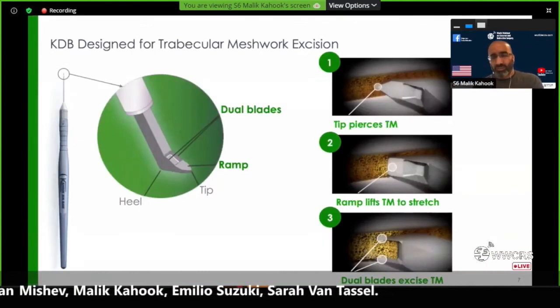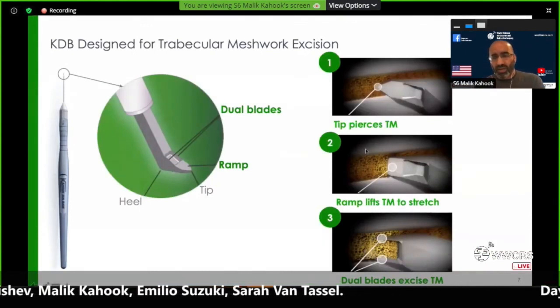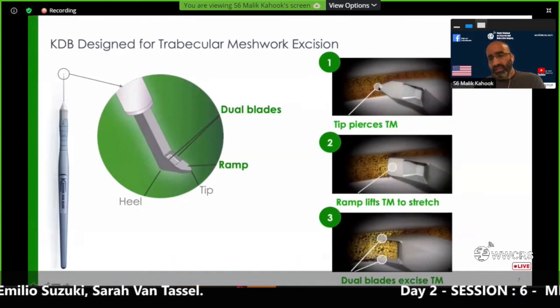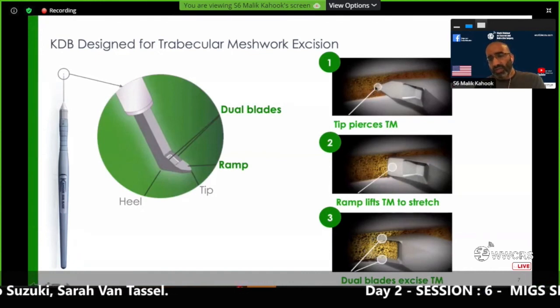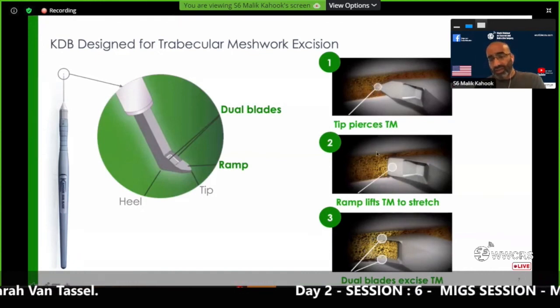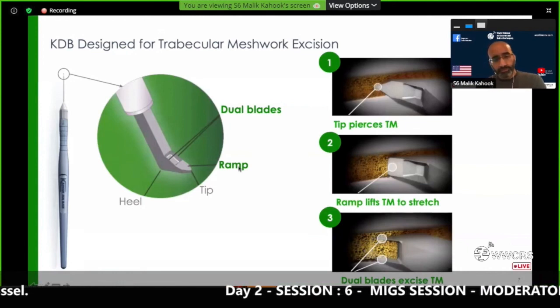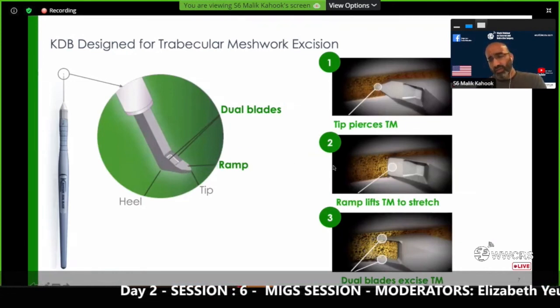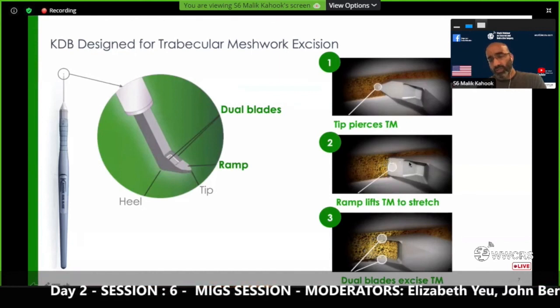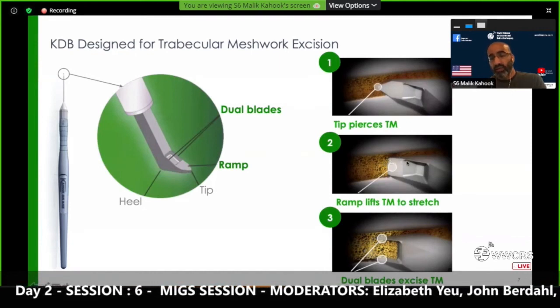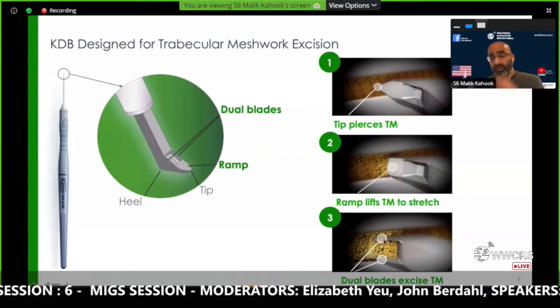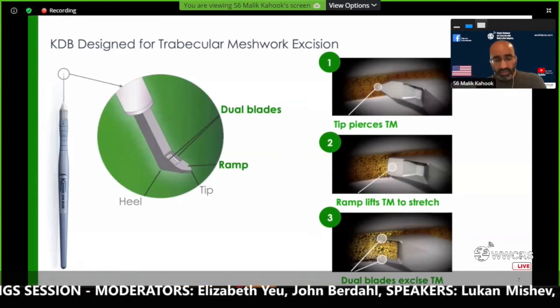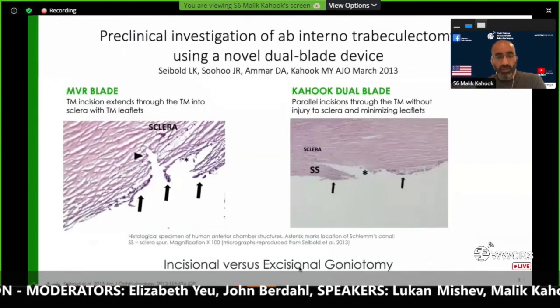In basic terms, in picture one the tip of the device goes into the trabecular meshwork, and then the key to the entire procedure is this ramp that elevates the trabecular meshwork up the ramp and towards these two blades. The two blades then create parallel incisions which allows you to excise a strip of trabecular meshwork.